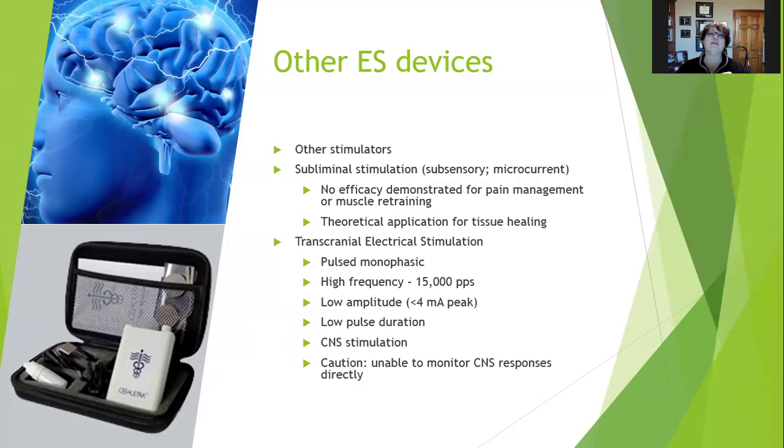There has been some research that supports using it for things like insomnia and PTSD, interestingly enough. There was a really big study that was done through the VA in San Francisco using microcurrent for PTSD, and it was shown to be effective.